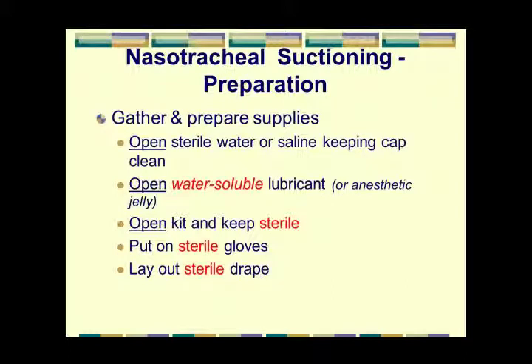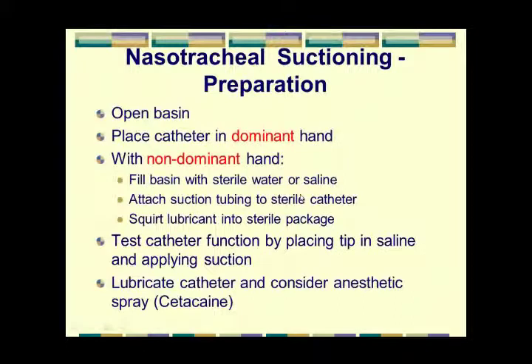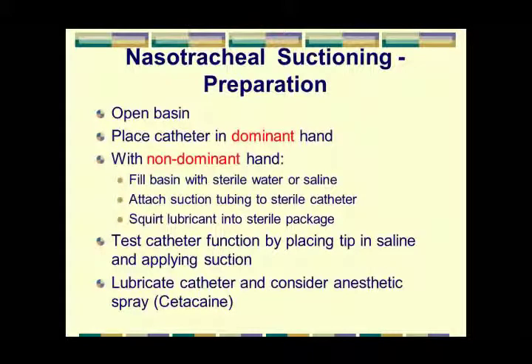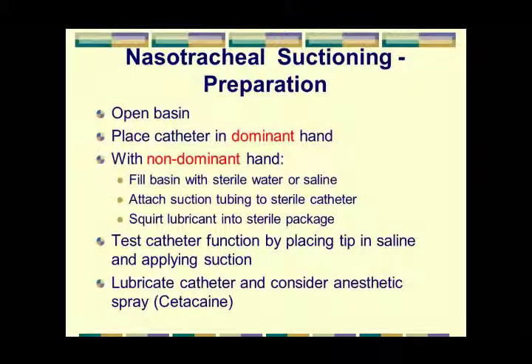Okay. I also have in there my sterile, there might be a sterile drape, not always. I have my basin. The basin is in the sterile field. Right now, both hands are sterile, so it doesn't matter which one I use. I reach in and I grab the basin. I set it down. Now I take the catheter, and usually use your dominant hand, whichever one that is.